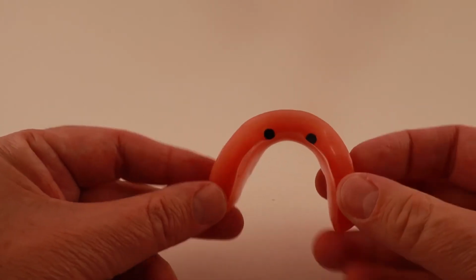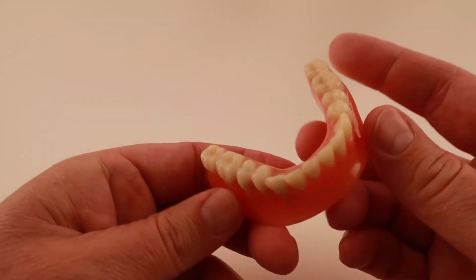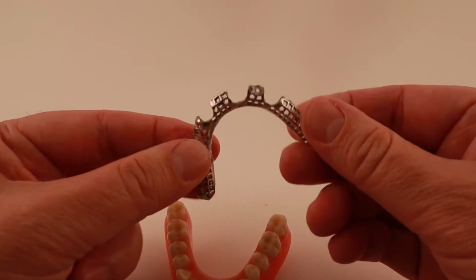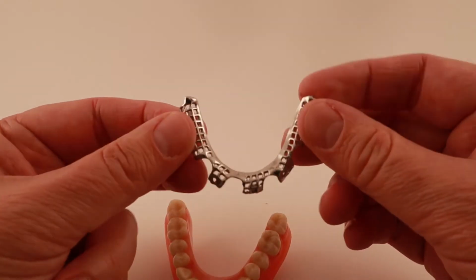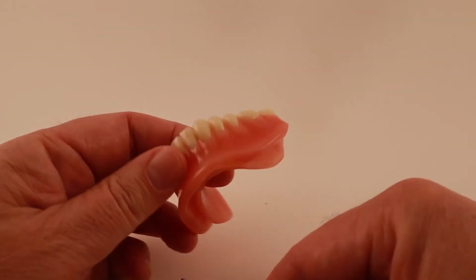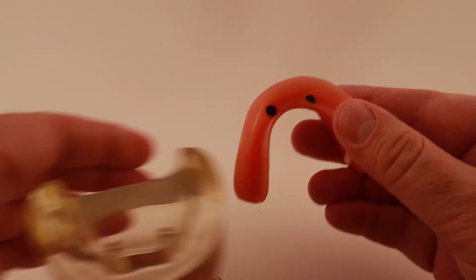For an implant retained overdenture, since the implants only hold it in, I start by making you a very well-fitting denture. In addition, I have a dental lab make a strong metal framework which will be embedded into the plastic of the denture. An overdenture needs the strong metal framework for two reasons. Reason number one is the snaps that attach the overdenture to the implants need to fit inside the overdenture.